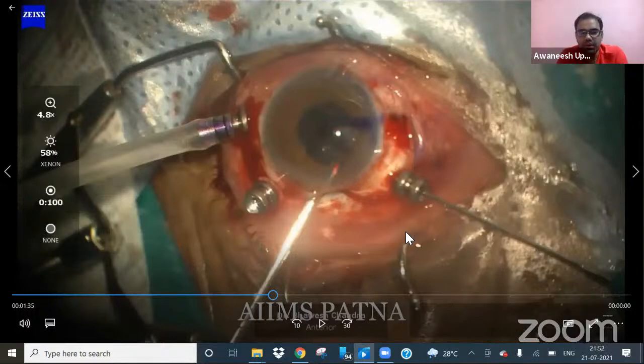Dr. Prabhu? For me, what is important is my second instrument. I always take my second forceps, usually a spatula, and ensure that I go under the optic, and then pull the haptic. So the optic comes above my second instrument, and then I lateralize the tissues, either iris or sometimes capsule. I lateralize, and at the same time I'm under the optic, so that the optic comes and there is a good path. That is very important for me.